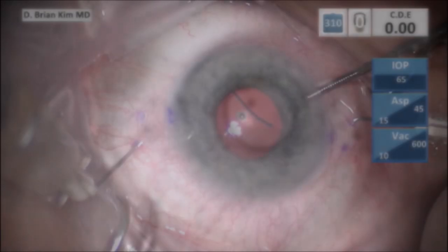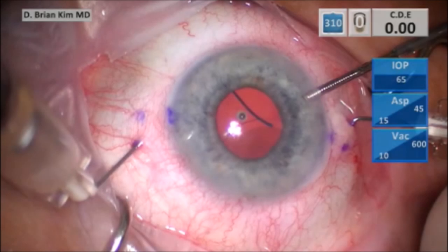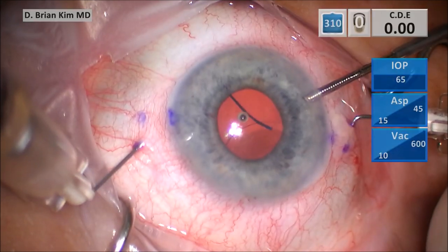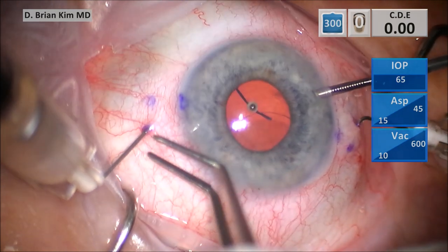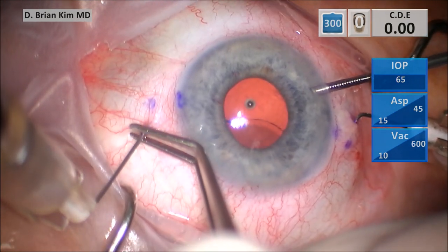And so you can see here that as I'm pulling this first haptic out on the left, there's significant tension on that left haptic. As you can see, the haptic is flexing outward, and this is not the normal position of the haptic.